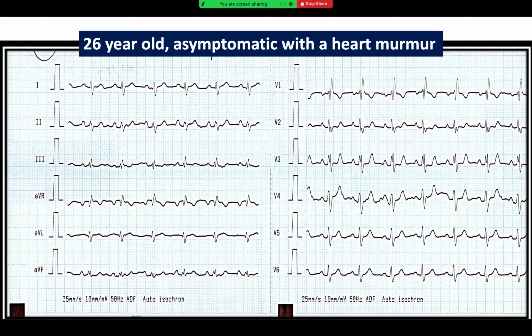So we notice it is a sinus rhythm ECG, and heart rate is slightly in the 90s. Yeah, agreed. How about the axis? It is right axis deviation. Then looking at the P wave, it is tall P waves. Yeah, so this is right atrial enlargement. Good. How about V1, V2? If we notice, right ventricular hypertrophy, right. Similarly, if we look in V1, rSR' pattern, and in the inferior leads, something interesting.